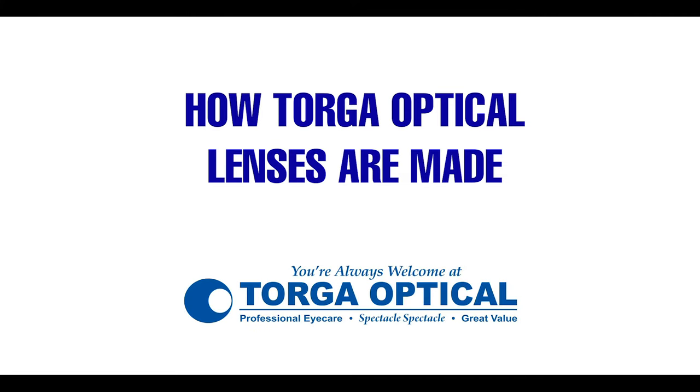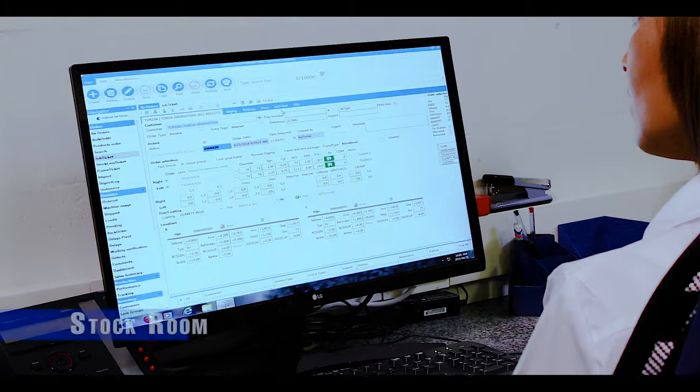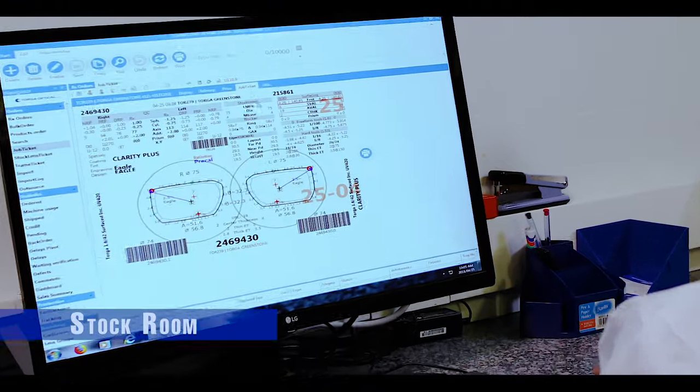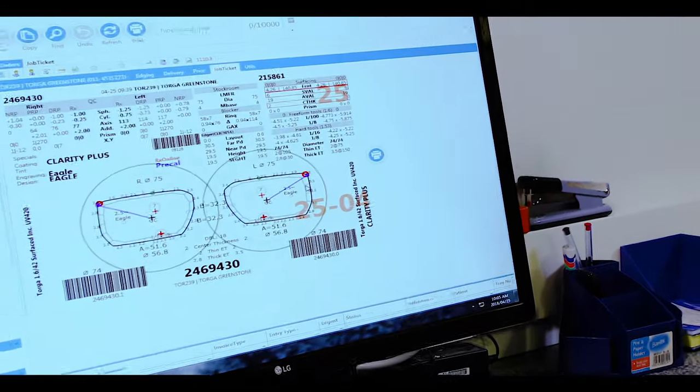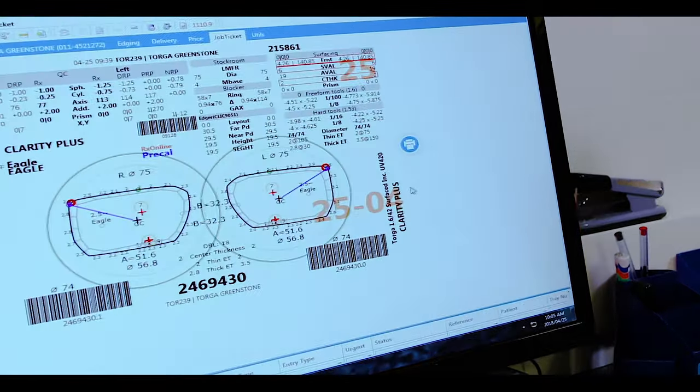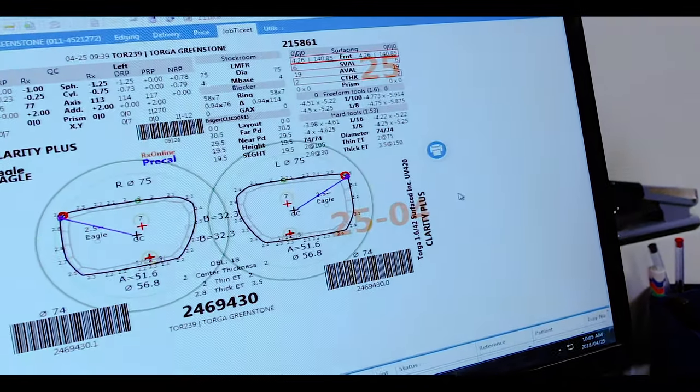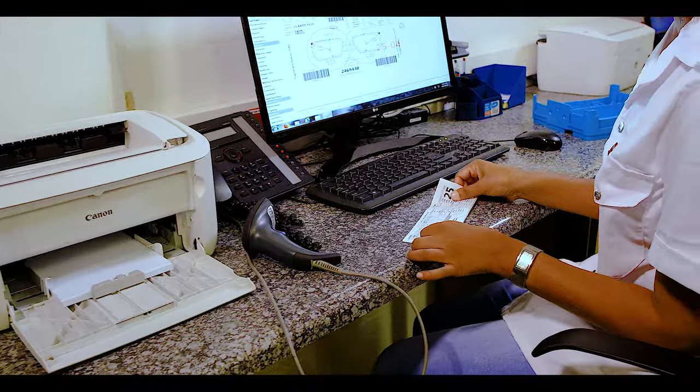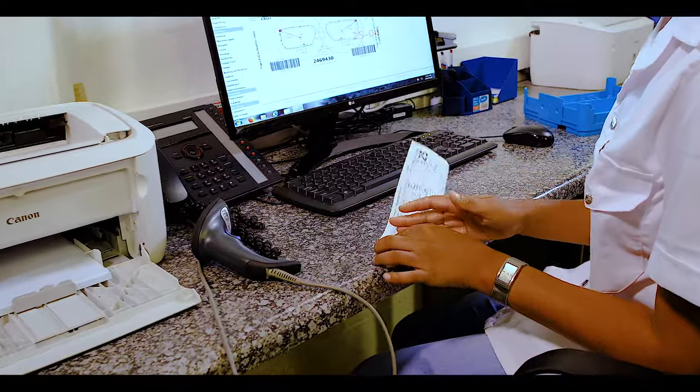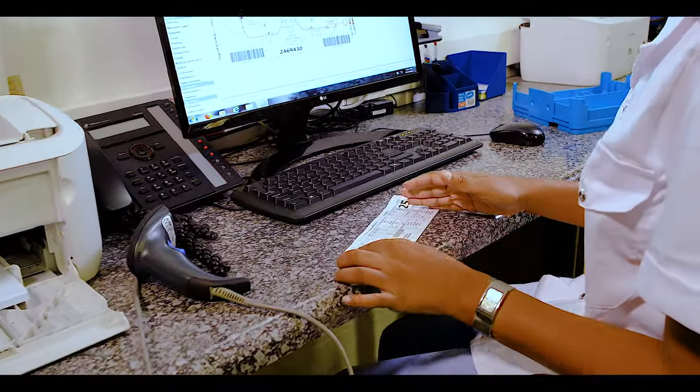Let's take a look at how we make your glasses at Torga Optical. Your lens order is received at Torga Lens via the internet. This is automatically entered into the system and put into production.